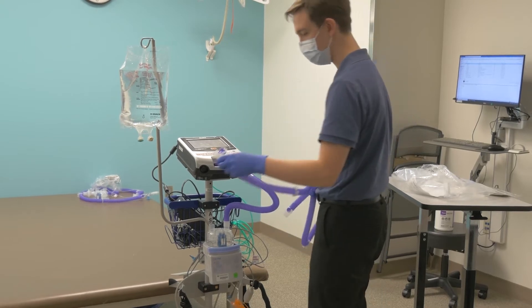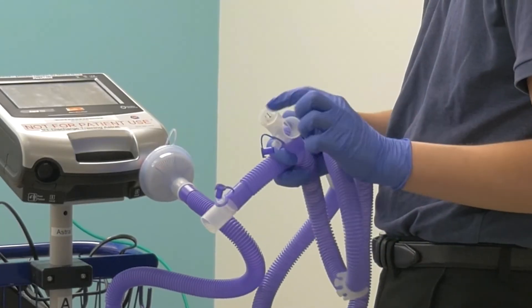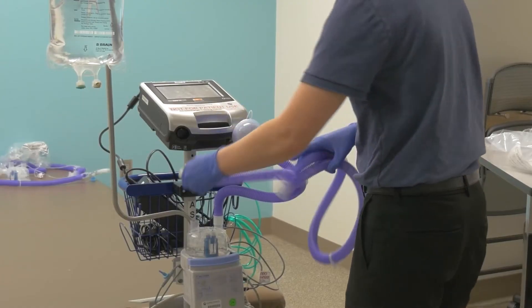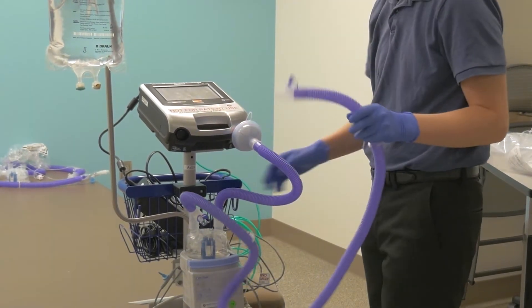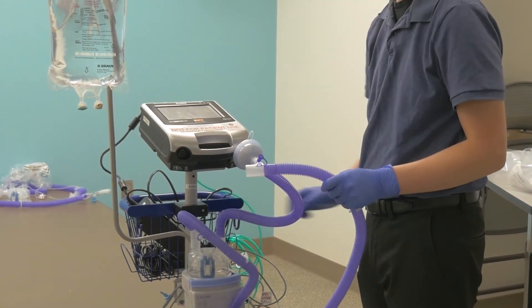After that, grab the longer ventilator circuit tubing. This circuit often has a Y-shaped end. Take the hollow opening of this side and place it onto the other available opening of the water chamber. If you forget which end of the tubing to use, remember the phrase: Y away from your child.